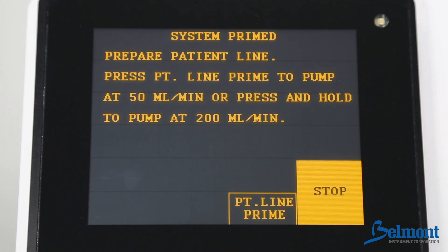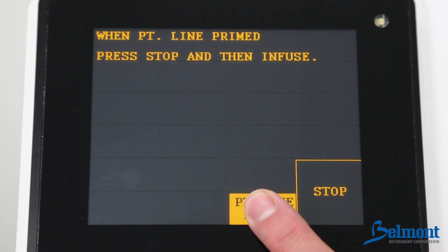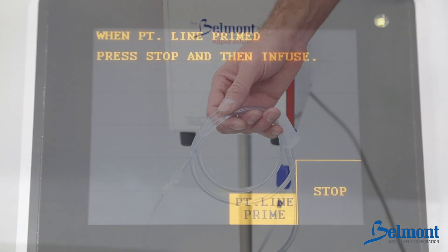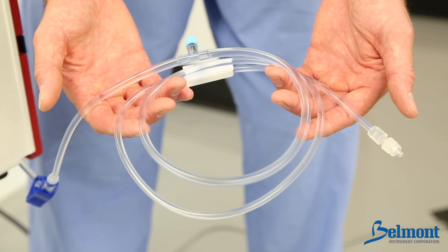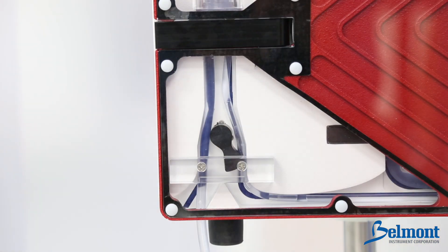The next screen will prompt you to prime the patient line. Press the patient line prime key once to prime at 50 milliliters per minute, or press and hold the prime key to prime at 200 milliliters per minute. Press stop after you have confirmed all air has been purged from the patient line. The system automatically enters a standby mode until you are ready to connect to the patient's catheter. Before continuing, please inspect and make certain that the patient line is completely primed and free of air. Any air bubbles after the patient safety valve wand must be removed prior to patient connection.